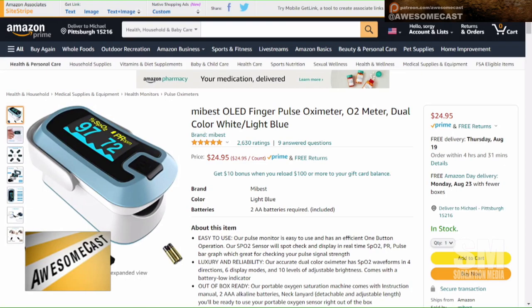I might have got a different model — it doesn't have the graph like yours does, but it gets the job done. It's very similar. I think it's a handy thing a lot of people should have, COVID or not. It's very cheap and very easy — it's basically what the doctor uses now. They don't put a thermometer in your mouth anymore, they just clip this on your finger. Yours is $24.95 — it's the MIBEST OLED Finger Pulse Oximeter.